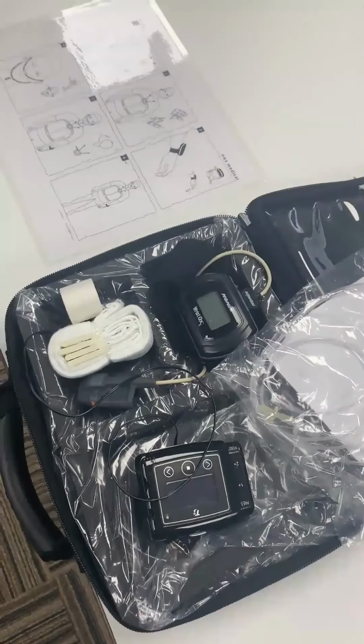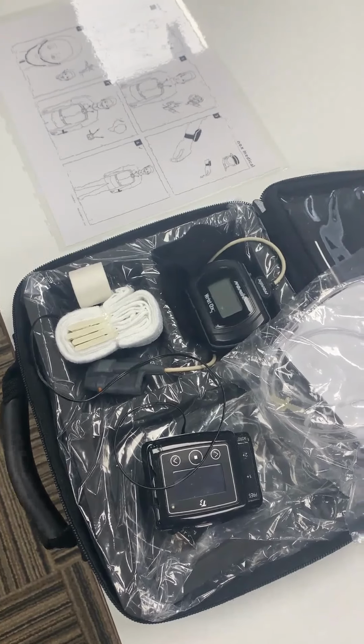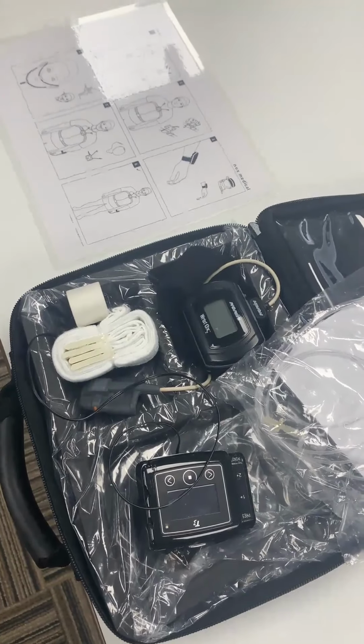So you are ready to do your at-home sleep study. Please make sure that this is the last thing you do before going to bed at night. So brush your teeth, put on your appliance, and now you're ready to hook yourself up.